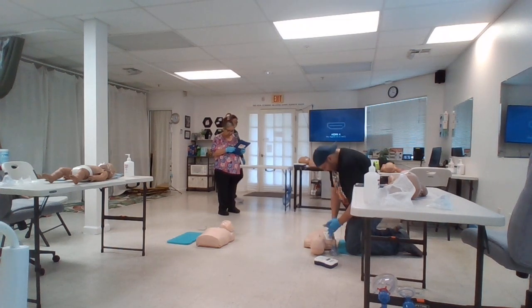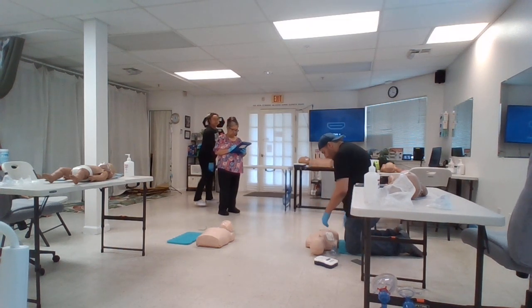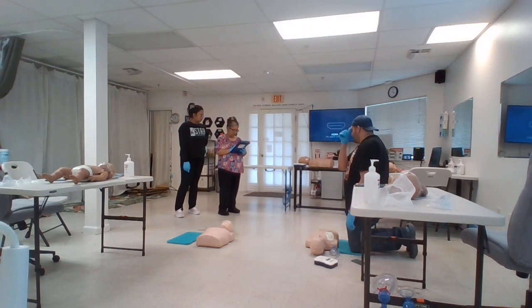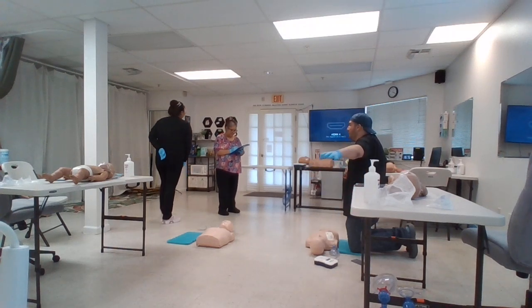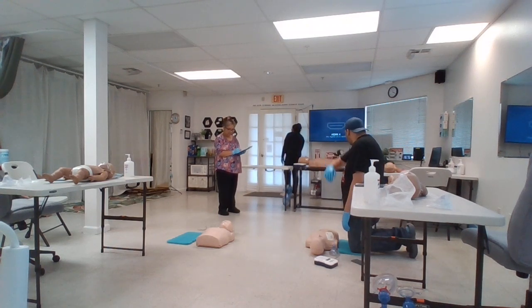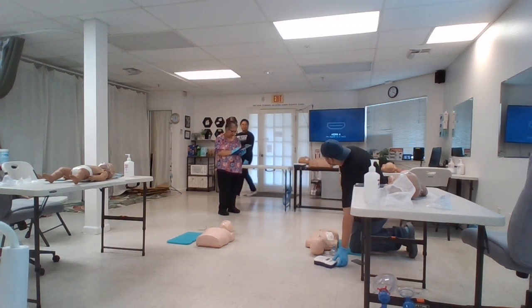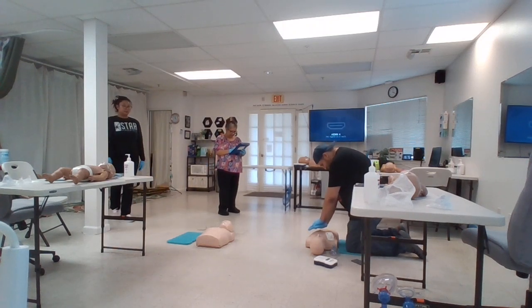patient is a child, press pads firmly on his chest. Do not touch the patient. Analyzing heart rhythm. Do not touch the patient. Analyzing heart rhythm. Shock advised. Do not touch the patient. Everyone clear. Clear. Shocking. Back off. Get away. Press the flashing shock button. Shocking. Clear. Shock delivered. Begin CPR.